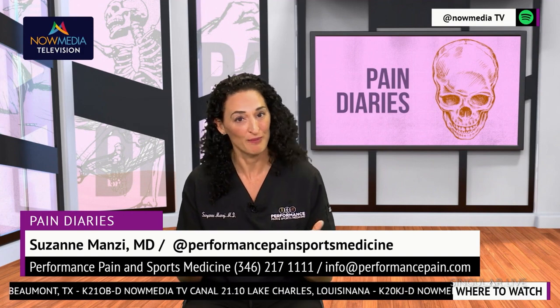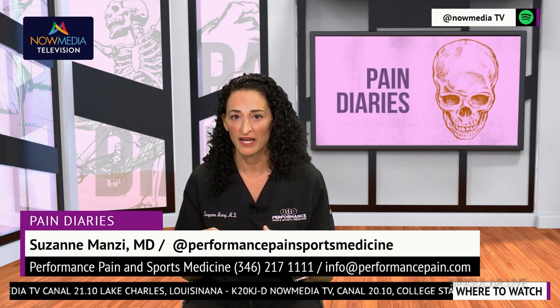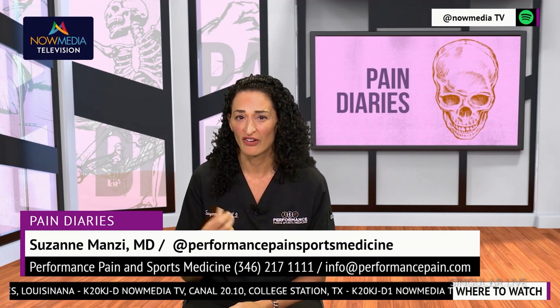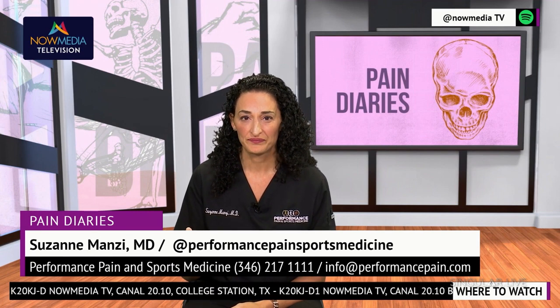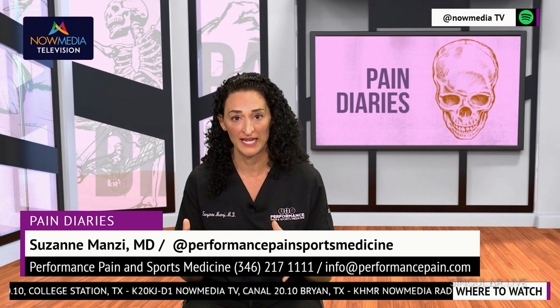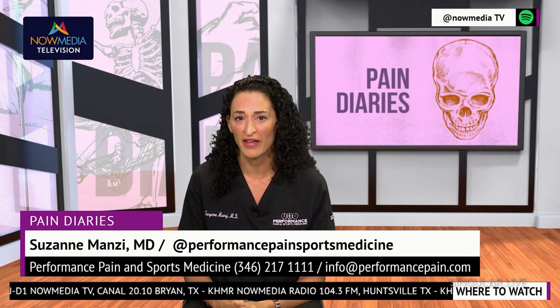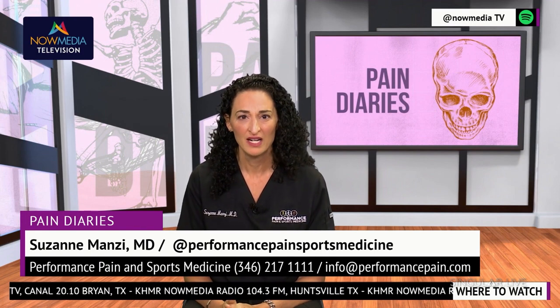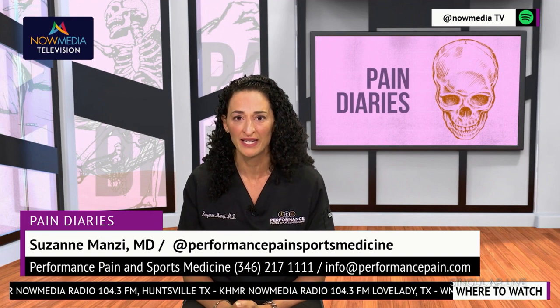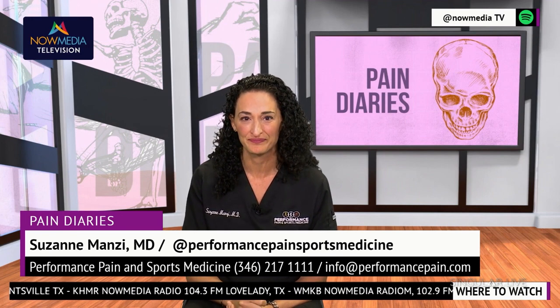So who's a good candidate for spinal cord stimulation? Usually, it's often recommended for patients who have chronic pain that has not been managed effectively with other treatments, and it can be used to treat a variety of conditions. Diagnoses include failed back surgery syndrome, complex regional pain syndrome, which is abnormal sensation after somebody has an injury or surgery, chronic neuropathic pain, arachnoiditis, peripheral neuropathy, diabetic peripheral neuropathy, low back pain or non-surgical low back pain, spinal stenosis, and nerve pain in the extremities.